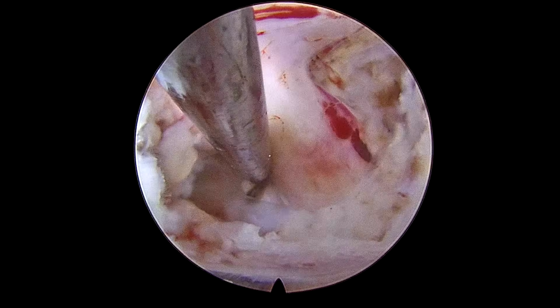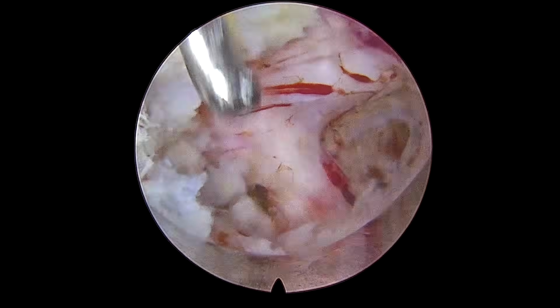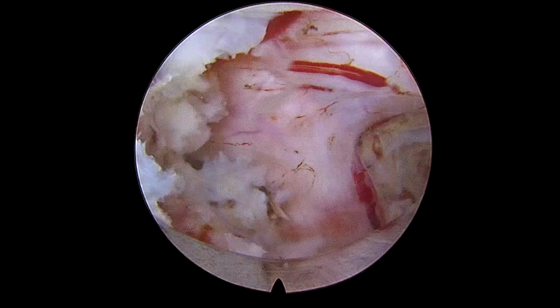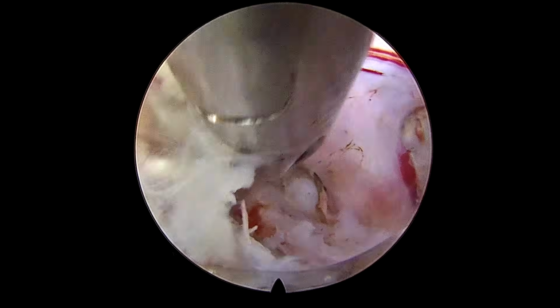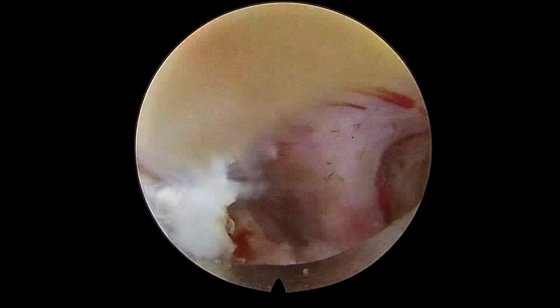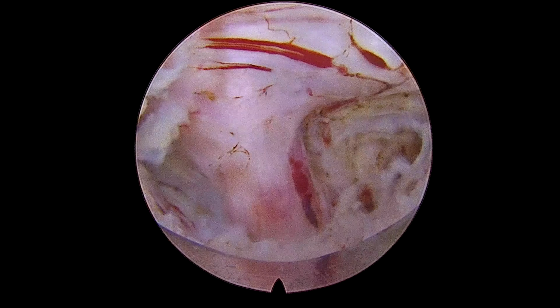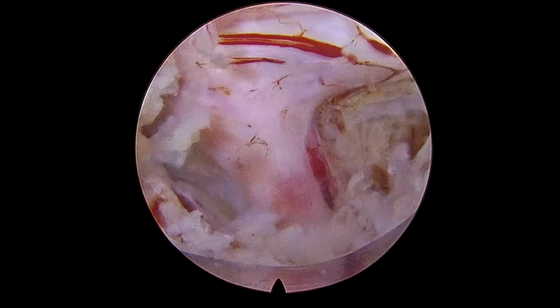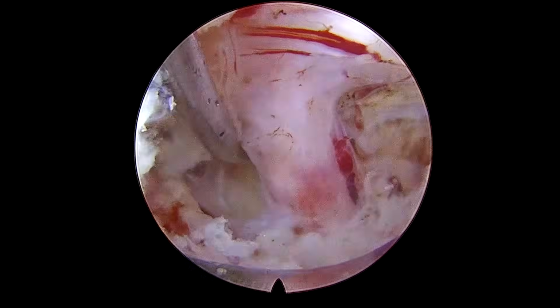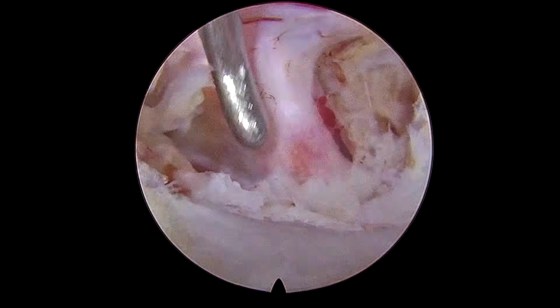I still expect there might be a few fragments. And this one is the fragment from the shoulder area. You can see here there was a fragment in the shoulder also, a big one. Now there is no fragment in the shoulder.